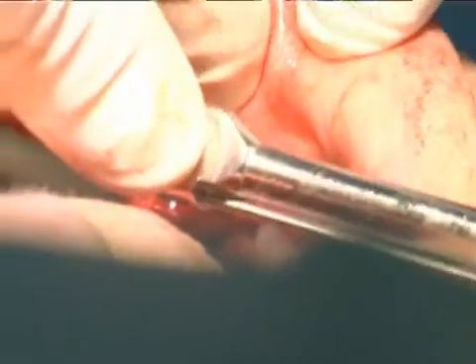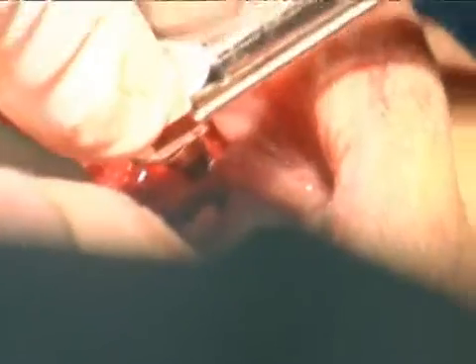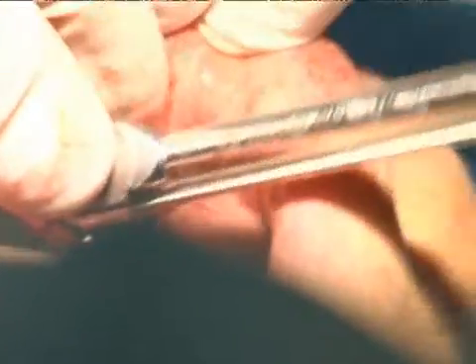And once it's flush with the bone, it gets up to about 35 Newton centimeters, which is very, very strong. If we can torque it to 35 Newton centimeters, then we're able to actually put a temporary on top, so kind of make it look like a natural tooth right away.